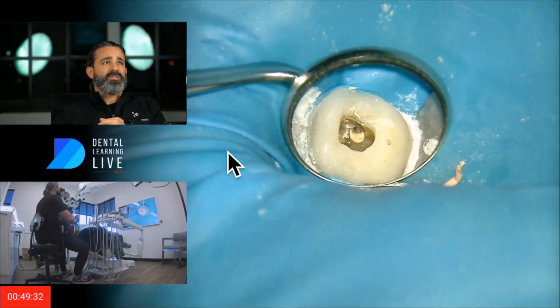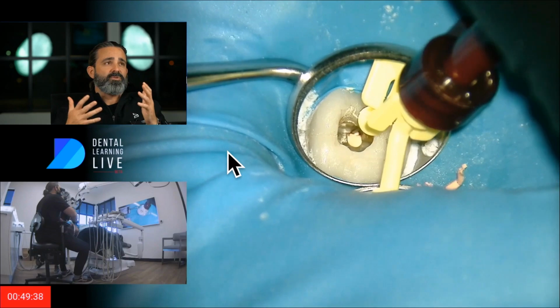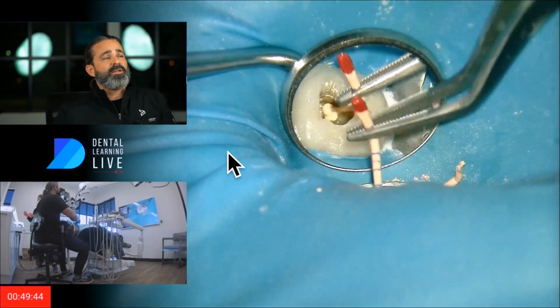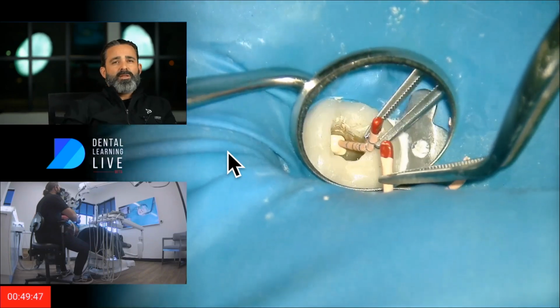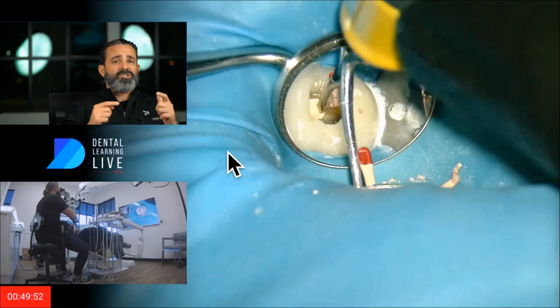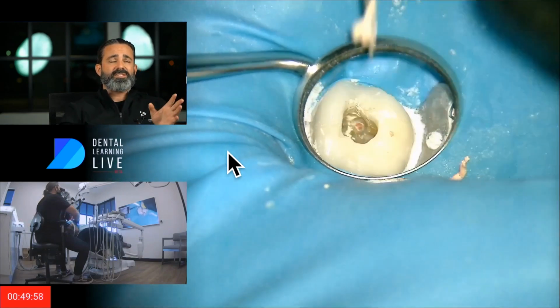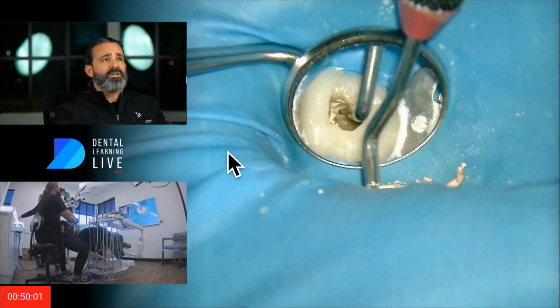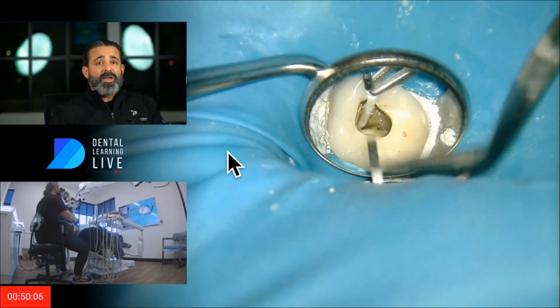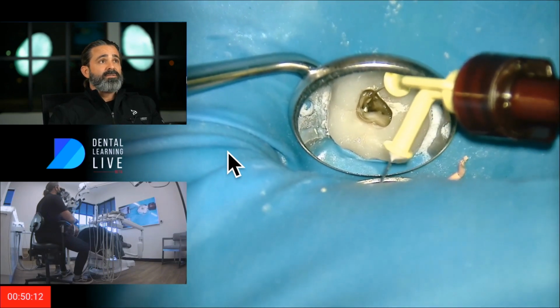I'm actually wicking the sealer out of the MB2. Basically, if something pushed through, I want to wick that out if that was extra fluid. That's my logic, right or wrong. And then I applied some sealer in the MB2 and now a cone. And I knew on the CBCT it was just 2-to-1, and I also knew in instrumentation they were 2-to-1. But I'm hoping it's 2-to-1 to 2, right? If you go back and study that CBCT, I'm looking for something extra in there. Make believe or not, I want another canal to be there. And I'm not going to know that right now unless my fluid did the job. So that's what's in my mind.